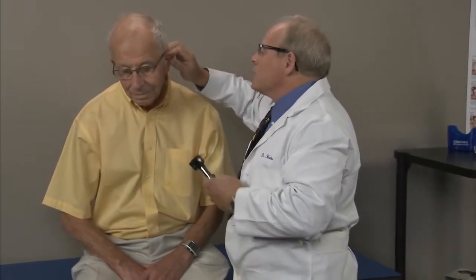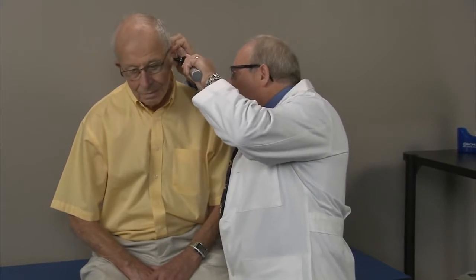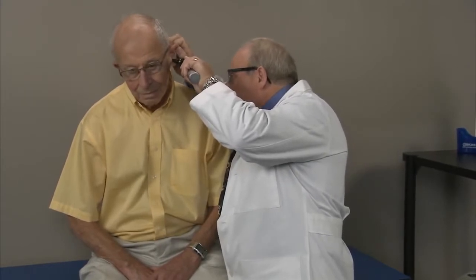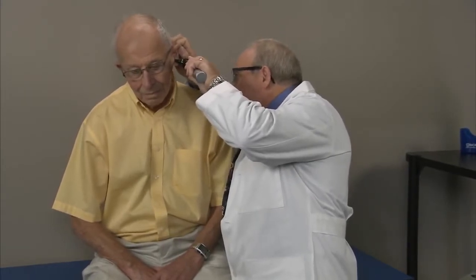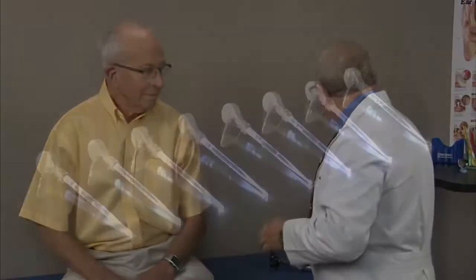Extending the ear canal doesn't work as well with adults because the canal is a little stiffer than with children, but it still helps straighten it. Looking in, I can see part of his eardrum but also a little bit of wax. I need to get that wax out of the way so I can do a good examination, so the first thing I'm going to do is select the proper ear curette.